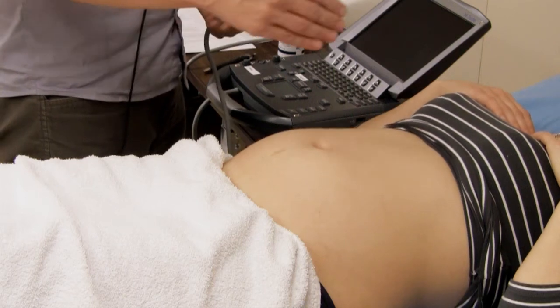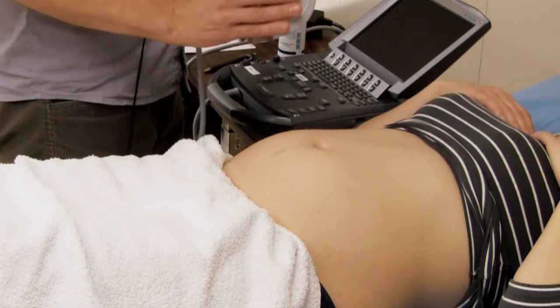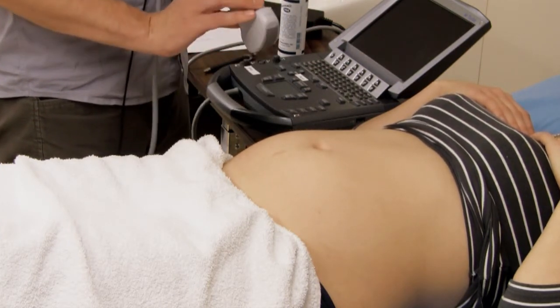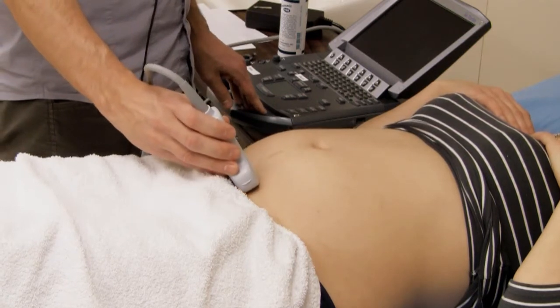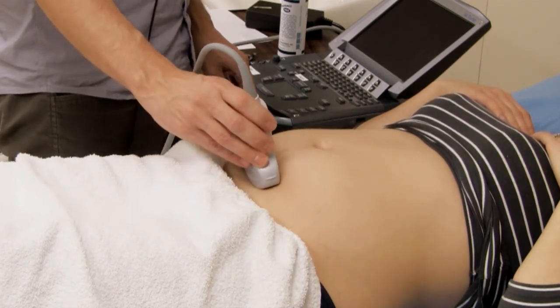Begin by mentally dividing the gravid uterus into 4 quadrants and then adjusting the depth setting to maximum. To examine for fetal presentation, begin with the probe in transverse at the symphysis and locate the maternal bladder. If you do not see the bladder, slide the probe cephalad.